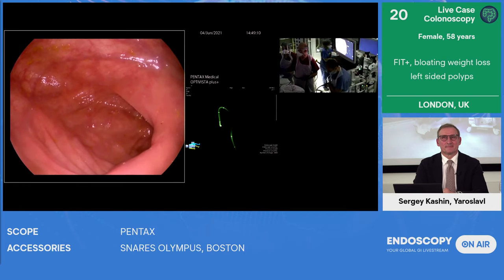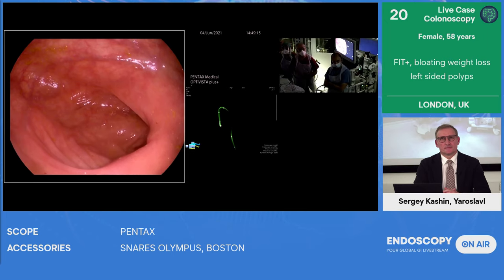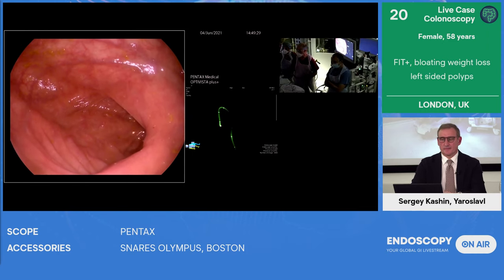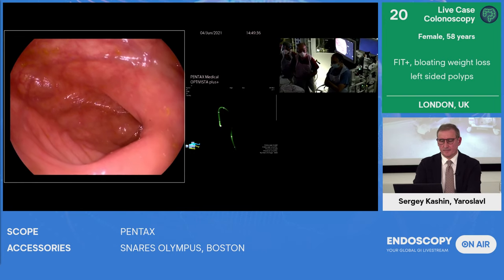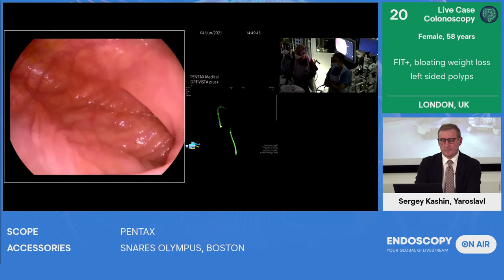So I was very pleased you gave me this difficult case, Ed. But we've got the Optivista, the Pentax Optivista Plus system. So knowing that this had been a technically difficult, previously failed colonoscopy due to diverticular disease in the sigmoid colon, I've used the pediatric scope, which is just 11.8 millimeters in diameter. And we've used the scope pilot system here, and I've managed to squeeze past the diverticular disease. She had a very high splenic flexure, which we then pulled back and straightened, and a reverse splenic flexure loop, which again, I derotated. And finally, we've managed to get round into the cecum.